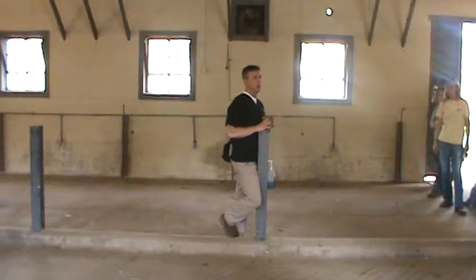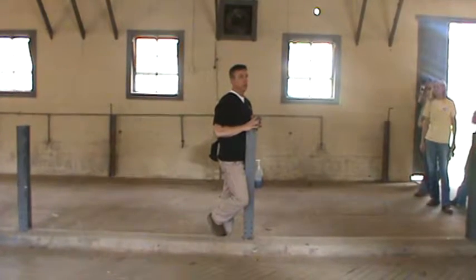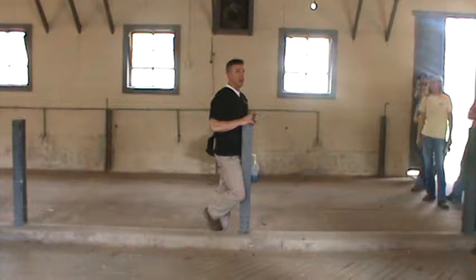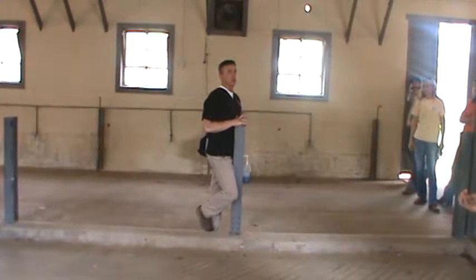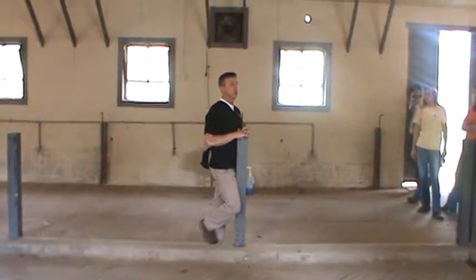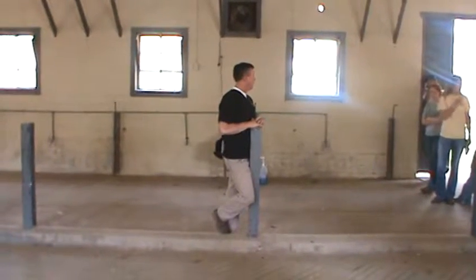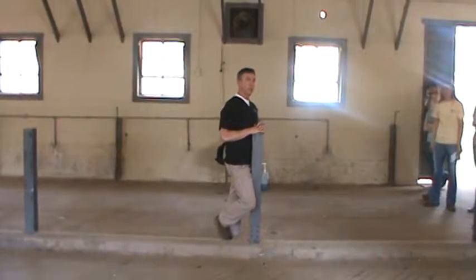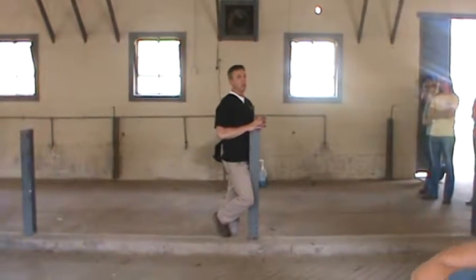Most mares tolerate being palpated and ultrasounded extremely well. But we don't have any stocks, and I don't know this horse. I've never worked on her before. I want you all to be able to look at the conformation of the vulva pretty well, and I don't want you to get kicked. I'm sure that none of you want to get kicked. So anyway, I gave her a little sedation. The point is that normally I wouldn't do that.